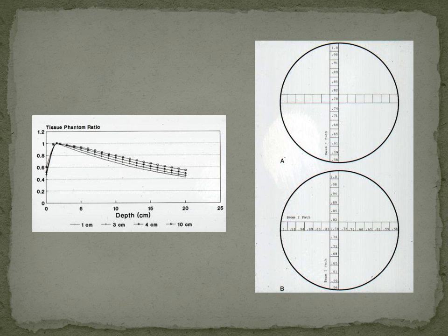Intensity goes down exponentially as the radiation penetrates through the patient. It's an e to the minus mu x absorption. There's some scatter radiation that perturbs that from a pure e to the minus mu x, but for these small beams, it pretty much is an exponential decay. And so what happens is if I have a single beam, I put it in, and if my target is here, I'm getting 78% of my dose onto the target.